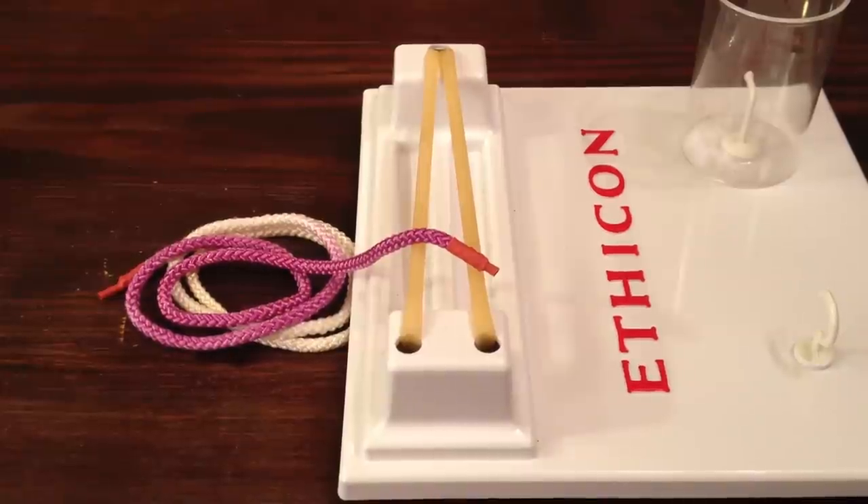Hey y'all, this is Dr. Amidere here. Today I'm going to be teaching you how to tie a two-handed surgical knot, and this video is specifically for all you left-handers out there. So let's get started.